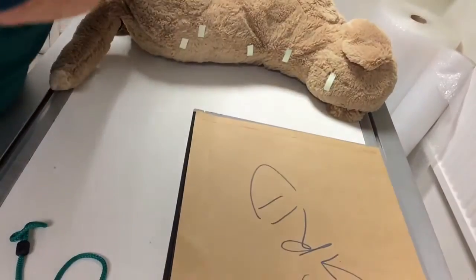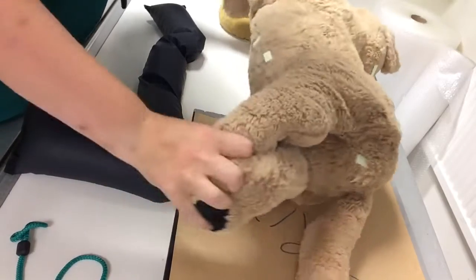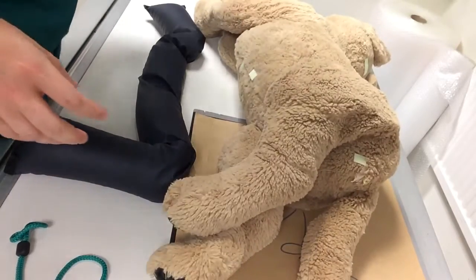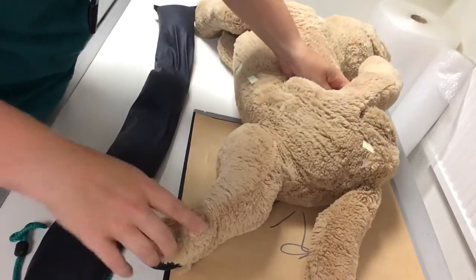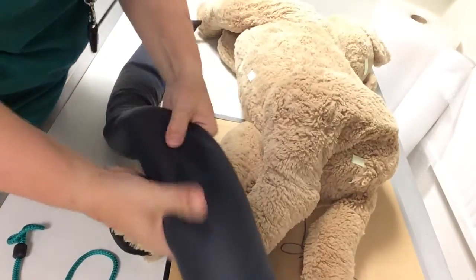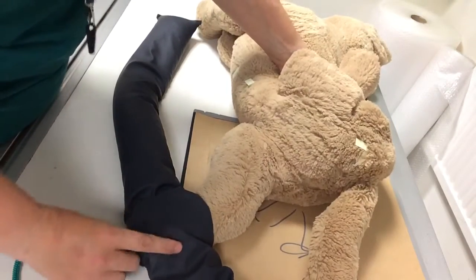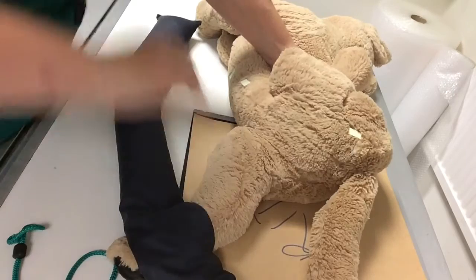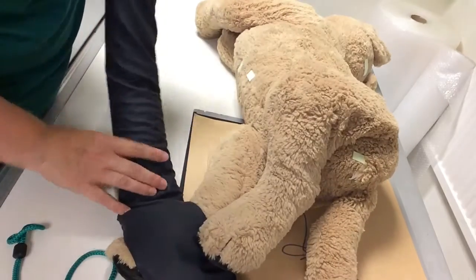Also when you're using sandbags, remember this isn't a 70 — you are demonstrating best practice, you are not role playing wrestling a 70 kilo Labrador. So if you are going to use them, get the sandbag to the end, get the sand to the end of the bag, and lay it over, because you've demonstrated that you're pulling back and holding it back.